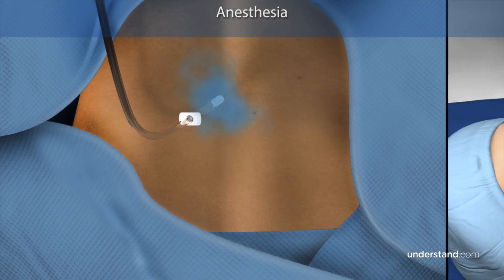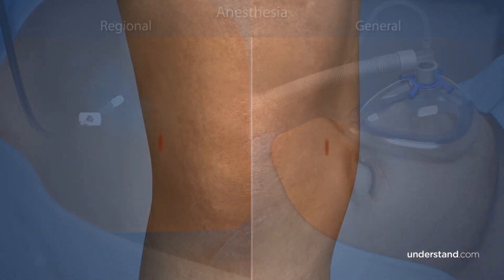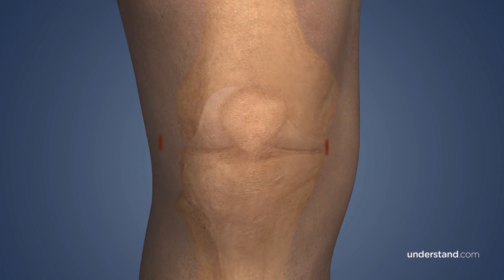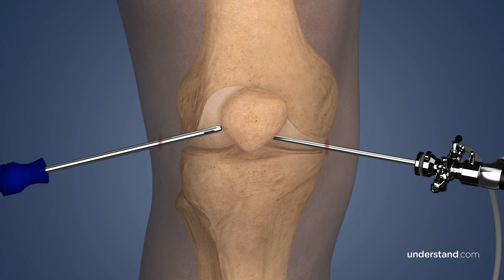Your anesthesiologist will determine whether to use regional or general anesthesia. An ACL reconstruction is typically a minimally invasive procedure, during which surgical instruments and a scope are passed through two small incisions on either side of your knee joint.